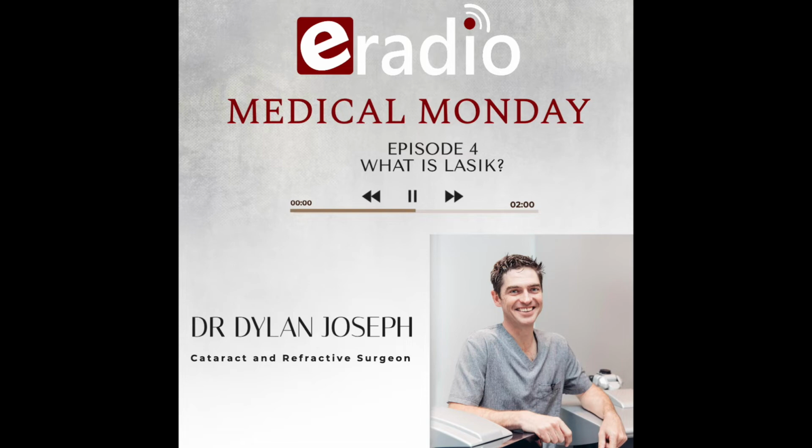So it delivered all the laser pulses onto the cornea in one shot, and it didn't actually profile the contour of the cornea very well. So if you think of the cornea, remember that we talked about it as being almost like a soccer ball shape, right? If you were to just laser a portion of a soccer ball, you'd flatten it and it would look like there's a bump.